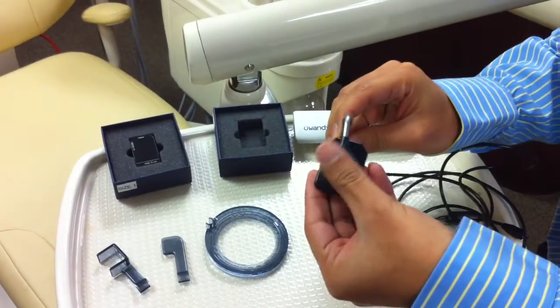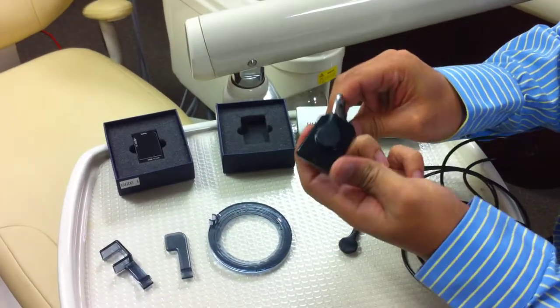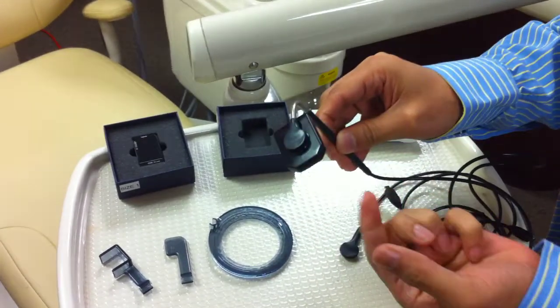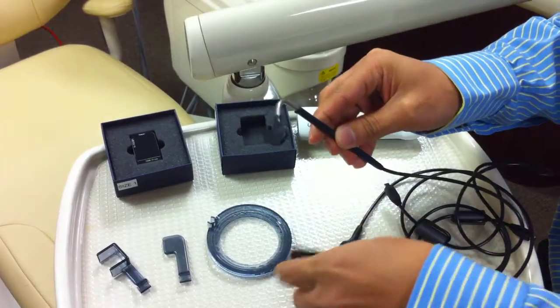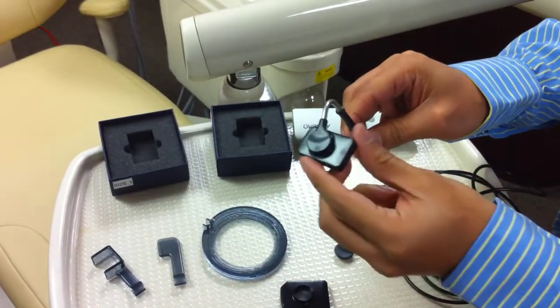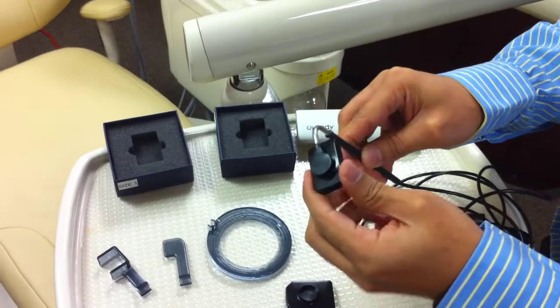It actually snaps on. You just push it in, and it snaps on and rotates 360 degrees, as you can see right here. If I wanted to switch between a size 2 and a size 1, I snap that off and snap this one on. So this is your size 1 that we just snapped on.